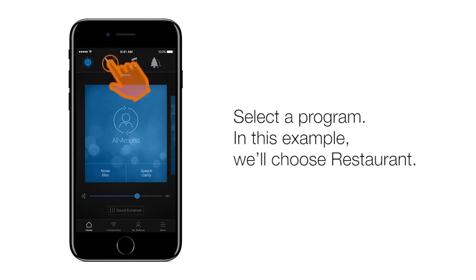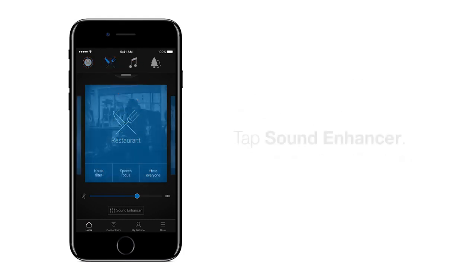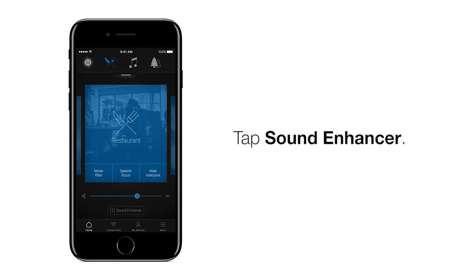Select a program. In this example, we'll choose Restaurant — the fork and knife icon along the top. Then tap Sound Enhancer, the button on the bottom just above the bottom menu.